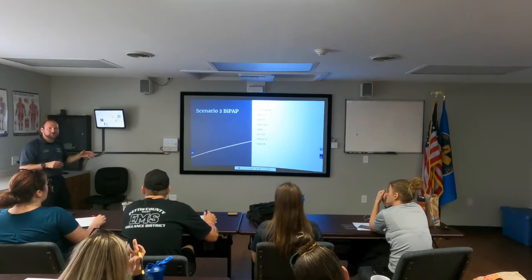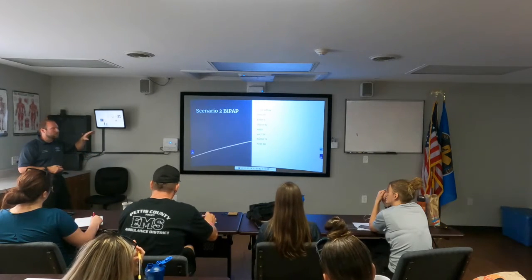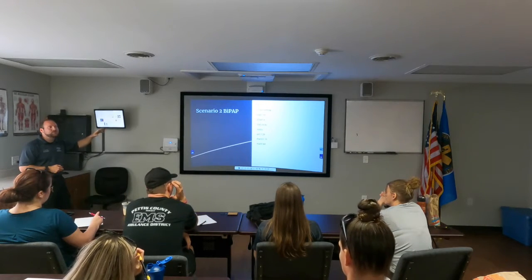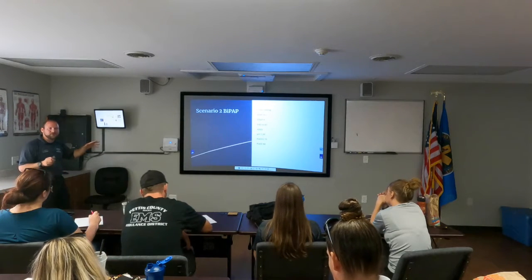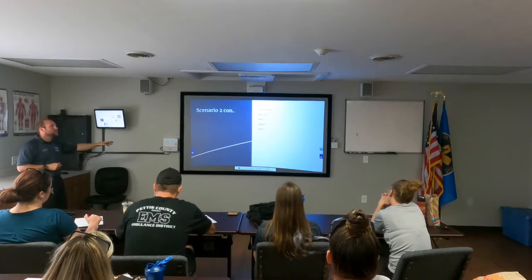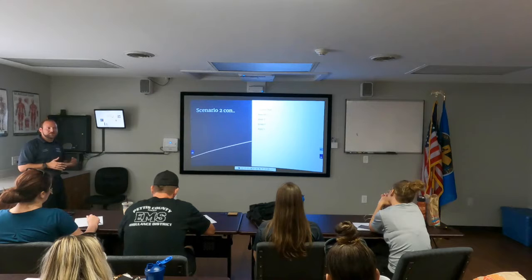Ask if they even have pressure support added with it. If they don't, then take what you get for your pressure support and add that to this. So your IPAP would be 16 over 4, so that you have the proper thing we need with pressure support. Again, current pressure support with that one is 6. We need to figure out what needs to be our new pressure support.